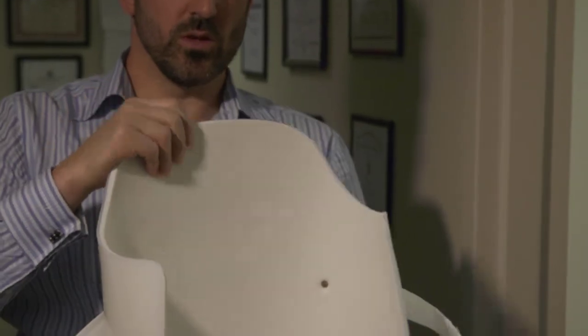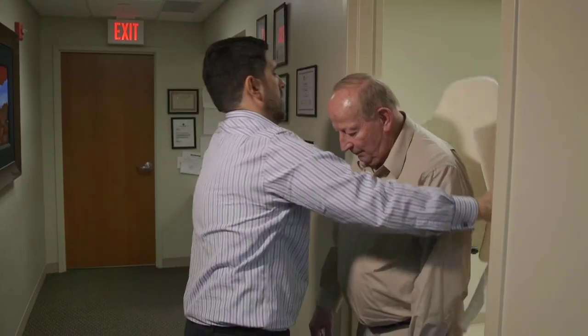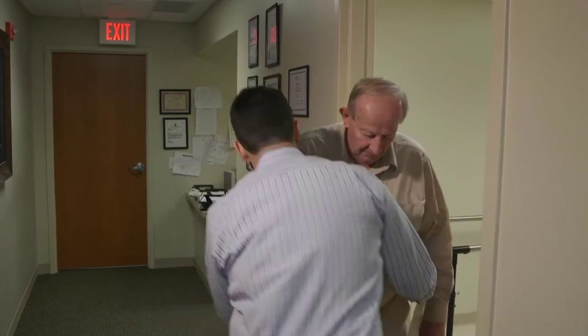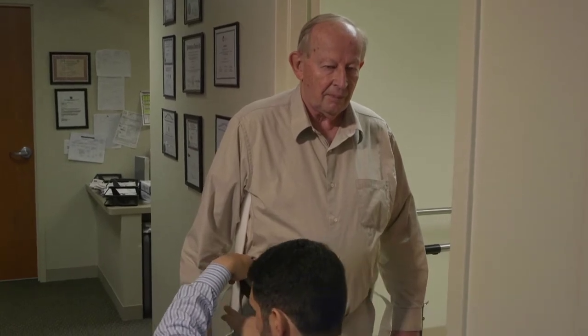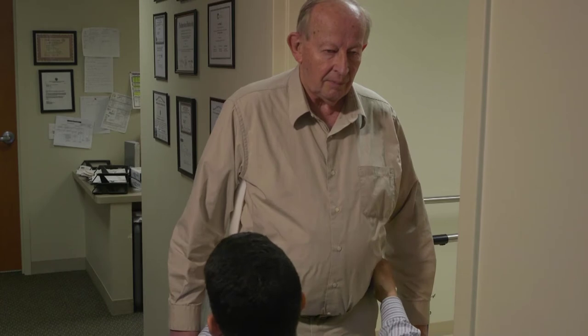We're going to put this on Bob now. I'm going to find the top of Bob's iliac crest right here, and I know where my groove is, so I have to come up on Bob a little bit.